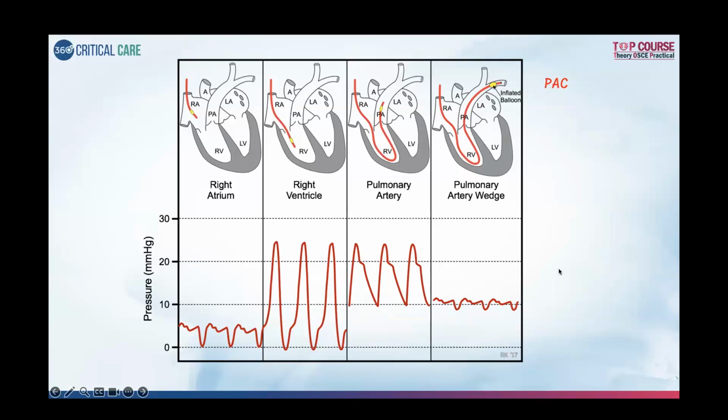Now again, half of the question will be about identifying the waveform where the catheter tip is. They can show you an X-ray to see how the PA catheter looks. And the further questions: what are the uses, like thermodilution, measuring pressure, titrating inotropes, titrating pulmonary vasodilators. These are the uses of a pulmonary artery catheter. They can ask you about the complications while putting it in.